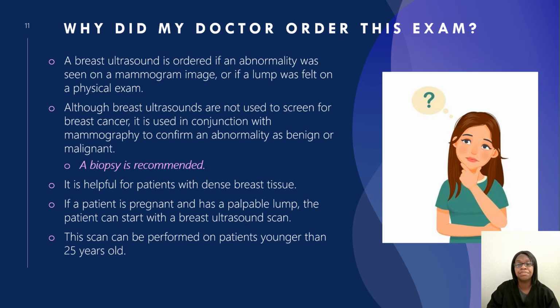Sometimes it's used of course whenever a patient comes in and they have pain. So if they had a mammogram and it was normal, but the patient just wants the breast ultrasound and they don't want to take the radiologist's word and they just want to know what is causing the pain. Sometimes having that breast ultrasound will give them some type of reassurance that nothing is wrong because you have patients who maybe have met their deductible or do not mind paying the ultrasound bill if they have to. So sometimes they just want that breast ultrasound scan done just to give them peace of mind.